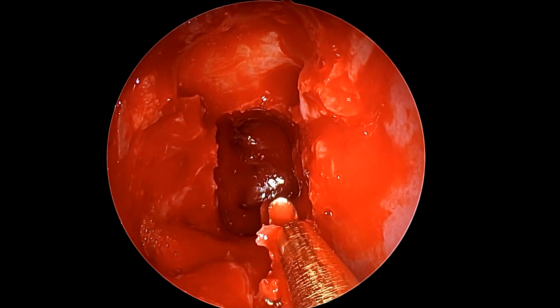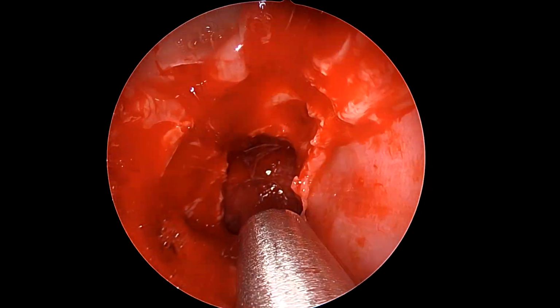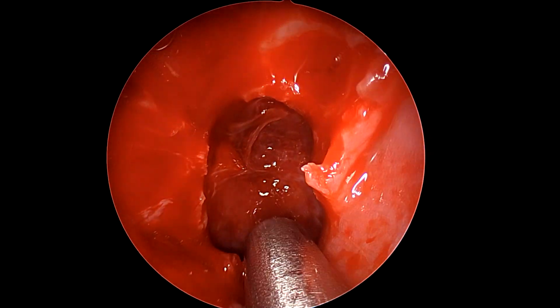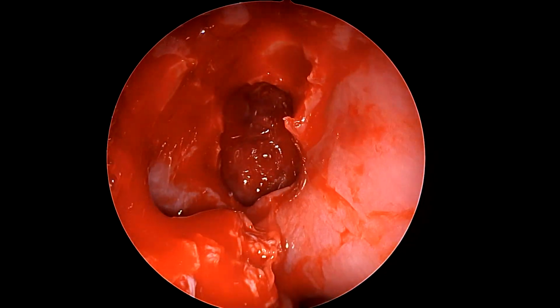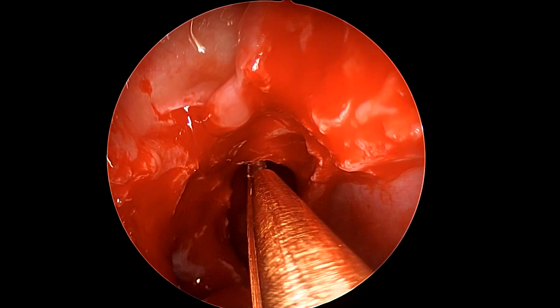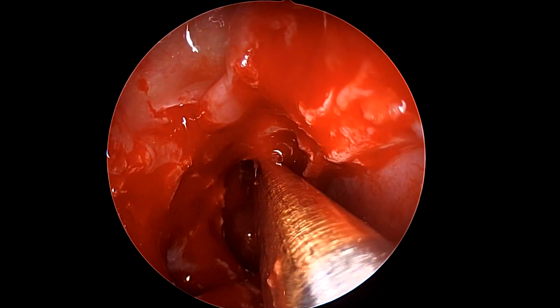The Kerrison punch is a very safe instrument for progressive bony resection. We get to palpate the amount of bone ledges left, and we can take very sharp bites. Smaller bites are advisable rather than very big bites, so as to avoid avulsing any bone or any critical neurovascular structure that is attached to it. So we are going progressively superior till we hit the flat bone of the planum sphenoidale.